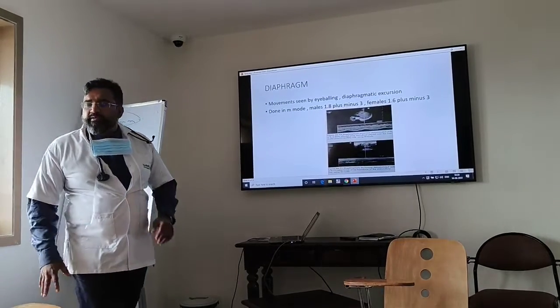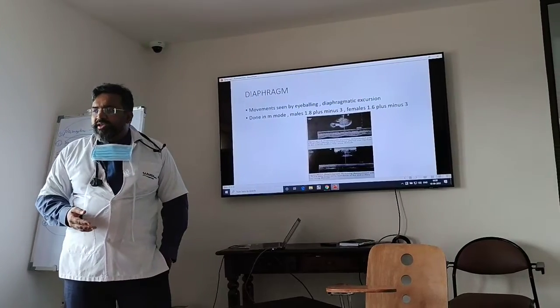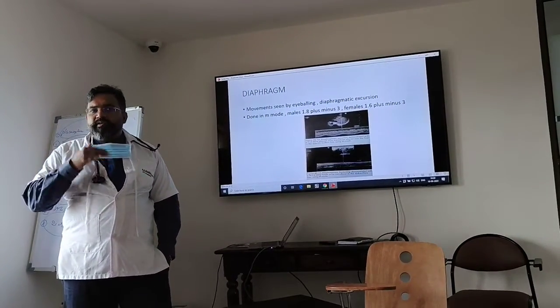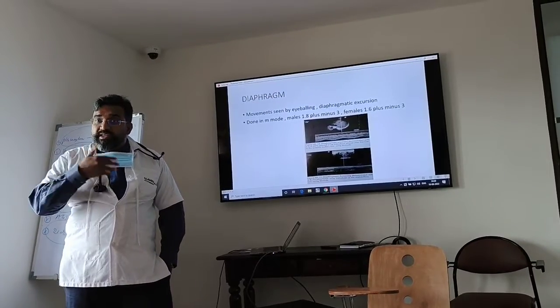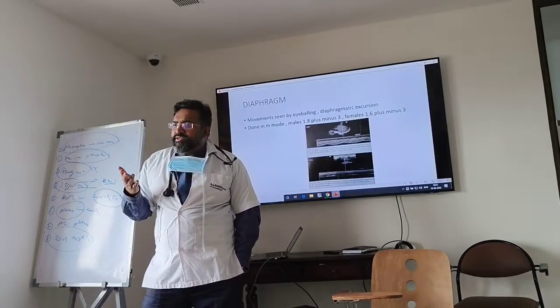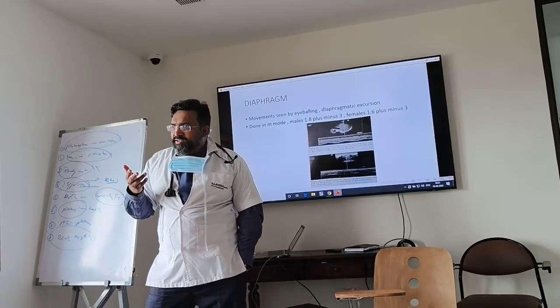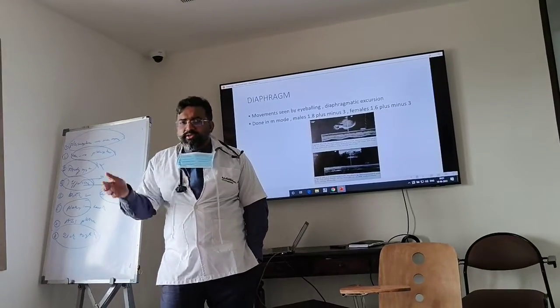Is it an indicator for intubation? It's not really indicated for intubation, but you have an idea, no, that the diaphragm is not okay. It's not been proven that you use diaphragmatic excursion to figure out intubation. It's not been proven. But we will at least come to know what is happening. Because GBS has not many diagnostic features that will make you decide on intubation. It's difficult. So it's a clinical call. So this will add to your clinical knowledge, no? Okay, this is what is happening.